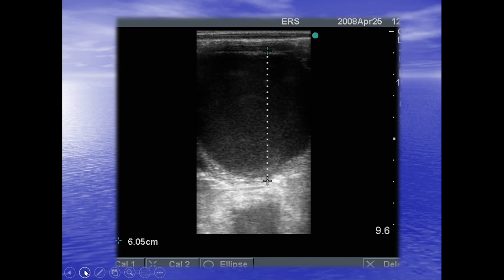If they become more widespread within the follicle, then they can be indicative of the mare going on to form an anovulatory hemorrhagic follicle, i.e. a type of follicle failure, which we'll talk about in a later webinar. But for now, I just want to introduce the subject to make this contrast between the normal pre-ovulatory follicle, which does develop some echogenic particles in that ventral margin, and the anovulatory follicle, in which they become more widespread.